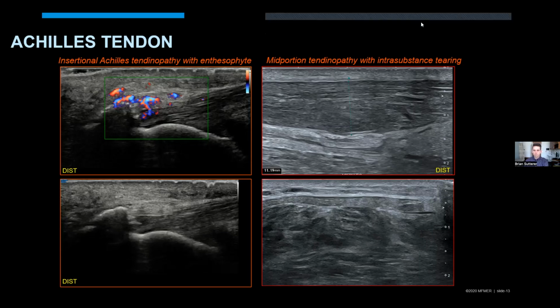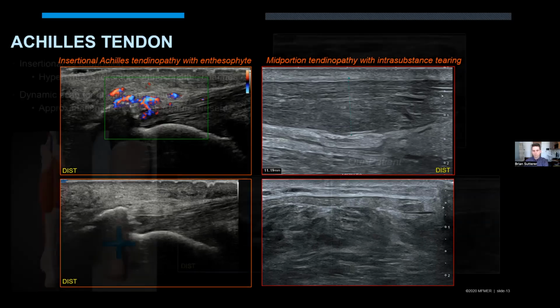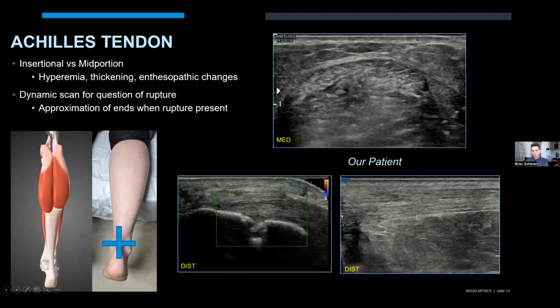When that pattern doesn't pan out, my radar goes up. So when I saw that erosion, my radar went up right away, and I asked, okay, is this something different? I think you've shown pretty clearly that that was erosion, but probably not the problem, because you clearly outlined where you thought the pain was. But I've had a number of cases where I think this is more of an enthesitis associated with seronegative spondyloarthropathy.